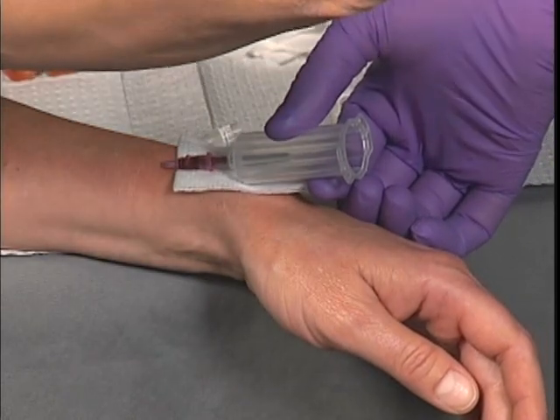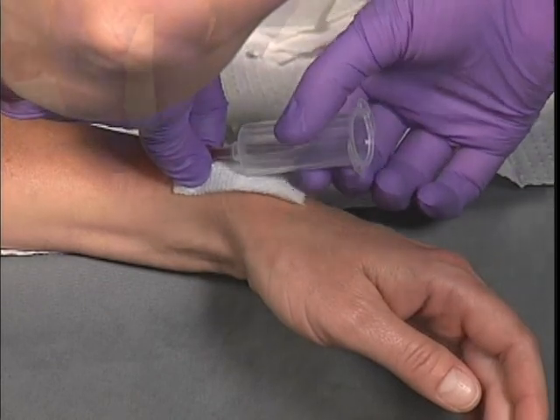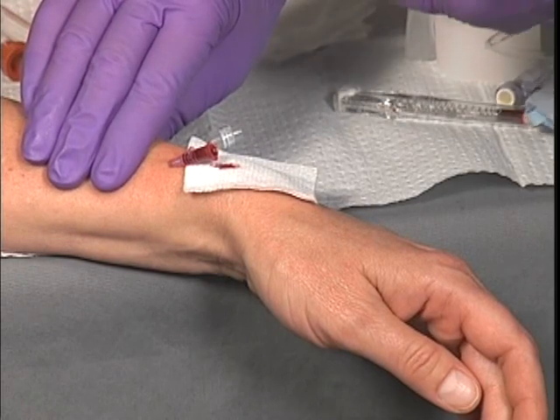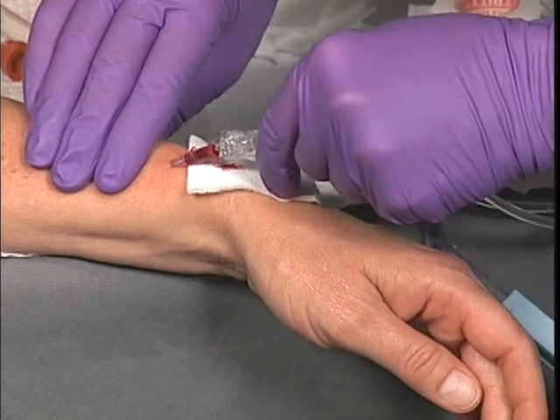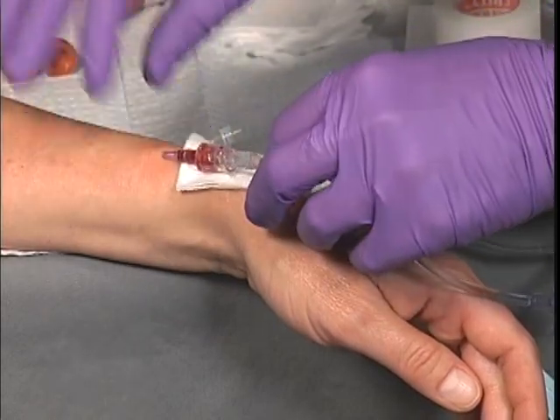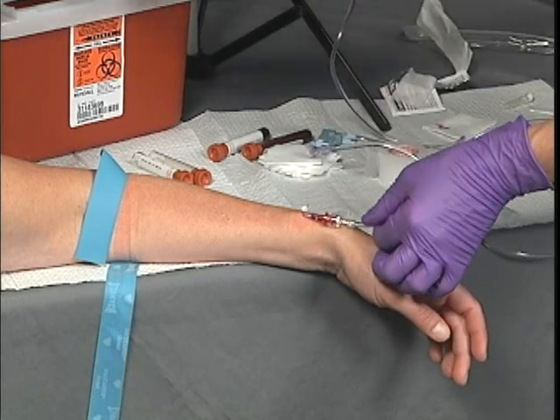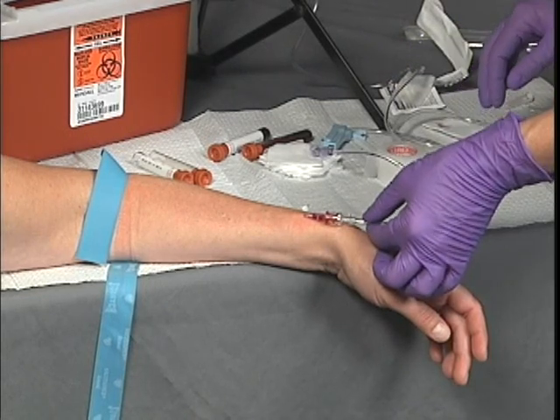After releasing the tourniquet, palpate the end of the catheter beneath the patient's skin and occlude the vein just proximal to the end of the catheter with direct pressure. With your free hand, remove the protective cap from the end of the IV tubing and attach it to the catheter hub, making sure not to push the catheter further in or pull it out. Open the IV flow clamp and observe the flow of fluid into the drip chamber. If the IV does not flow, ensure the tourniquet has been released and carefully adjust the catheter while observing the drip chamber, as the tip may be occluded by a valve or the side of the vein.